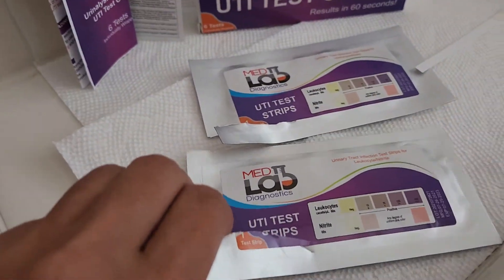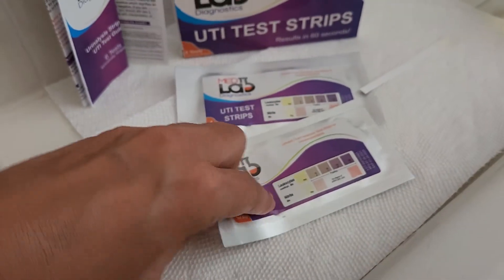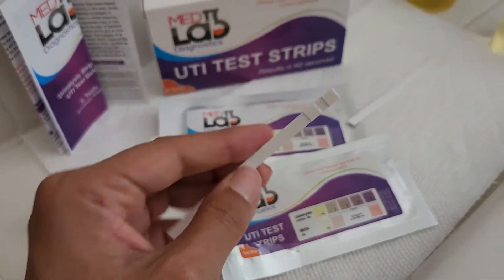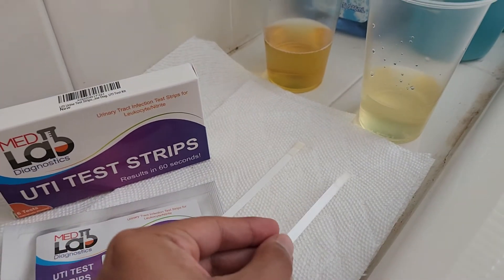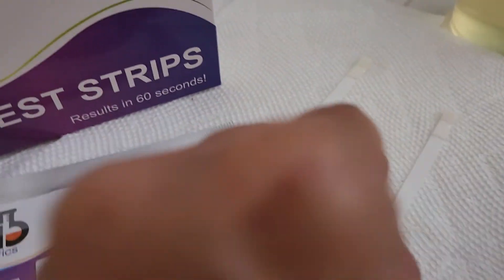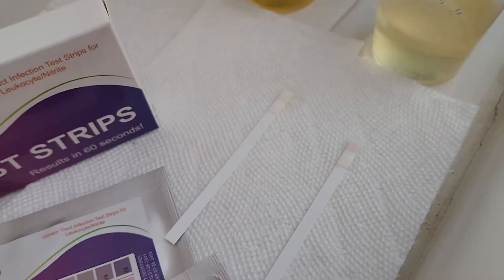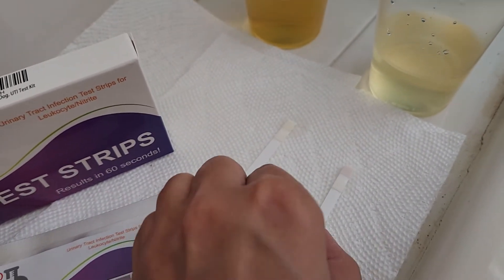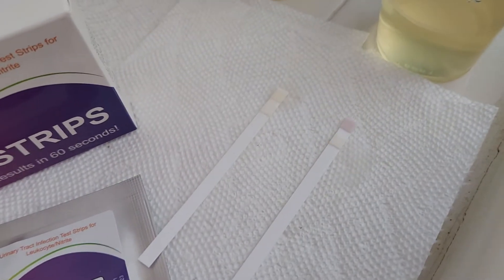In the meantime we're going to go ahead and also test the second urine. Checking the strip — looks good. So we'll go ahead and dip the second urine and lay it down. You just wait 60 seconds for the result, but you can already see that a color change is beginning to happen on that second sample.